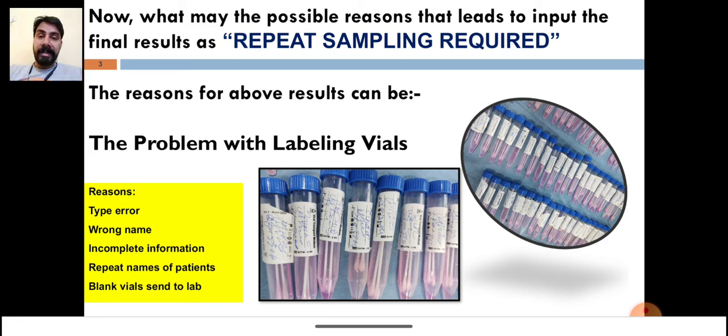This is the problem: typo error, wrong name. For example, there are four patients with the same name and they put the same name on four vials and send them to the lab. How will the lab differentiate? Incomplete information on the vials, repeat names of patients, even sometimes blank vials are sent to the labs for testing.